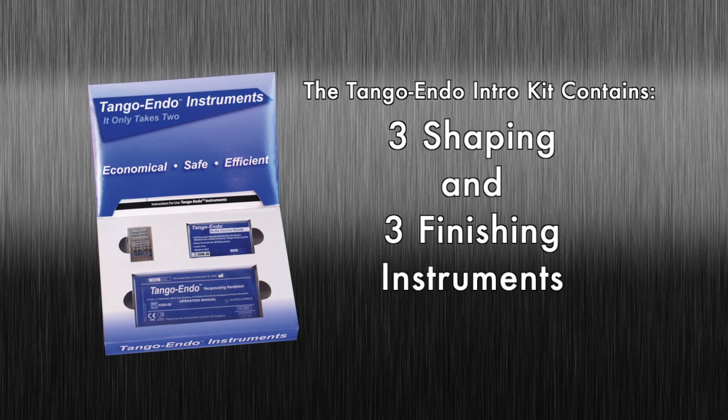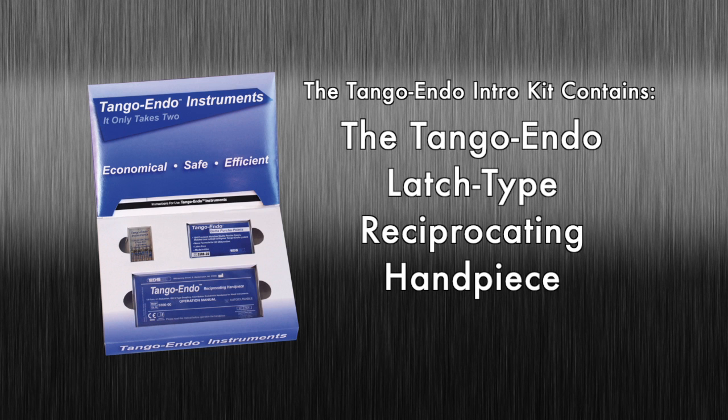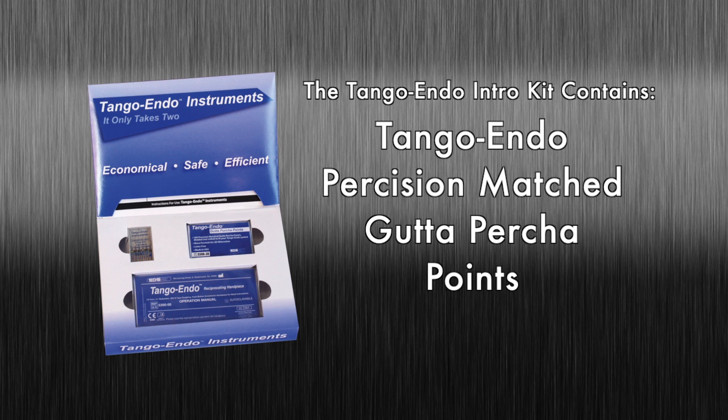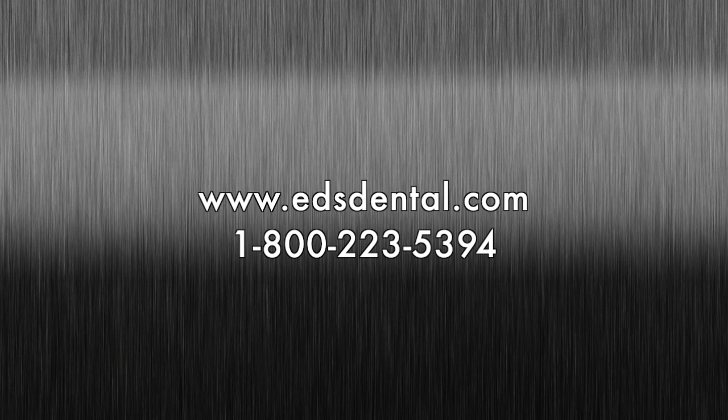The Tango Endo introductory kit contains everything you need to complete a great endo procedure. The kit includes 3 Tango Endo shaping and 3 Tango Endo finishing instruments, the Tango Endo latch-type reciprocating handpiece, and a box of precision-matched Tango Endo gutta percha points. Order your Tango Endo system and refills today — visit www.edsdental.com or call 1-800-223-5394 for more info and ordering.